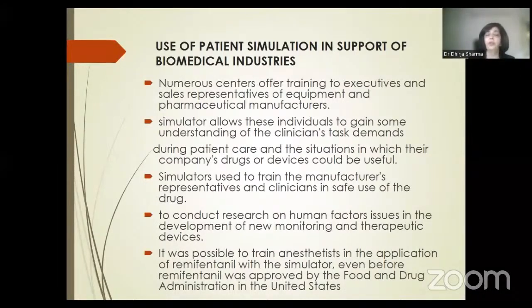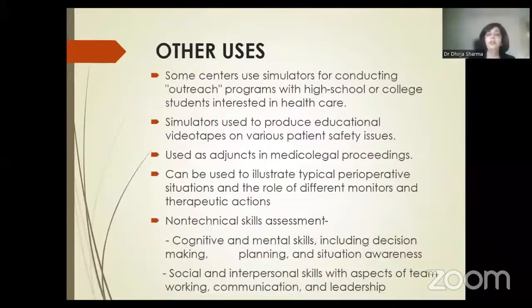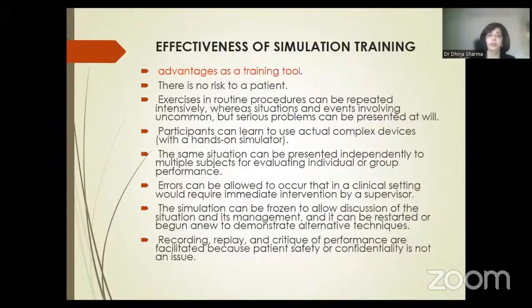In fact, it was possible to train anesthetists in the application of remifentanil with a simulator even before remifentanil was approved by the FDA in the USA. Some centers use simulators for conducting outreach programs, say for high school and college students, for teaching them BLS, etc. Simulators used to produce educational videotapes can be used as an adjunct in medico-legal proceedings, can be used to illustrate typical perioperative situations, the role of different monitors and therapeutic actions, and can also be used in non-technical skills and soft skill assessments.